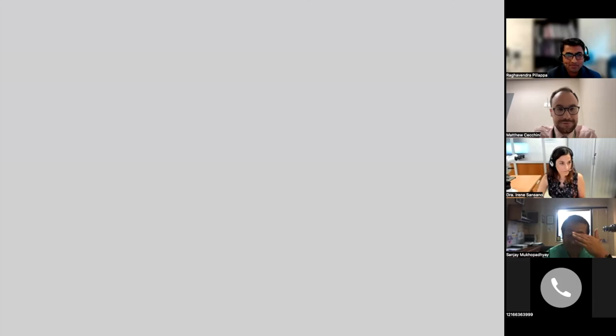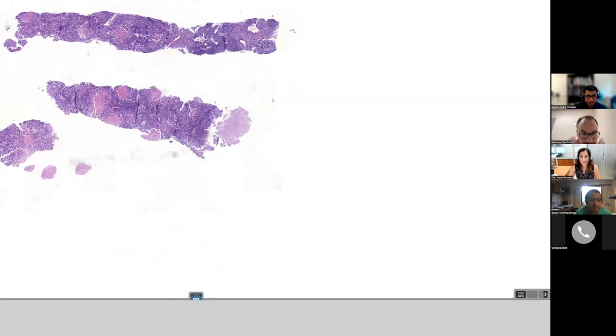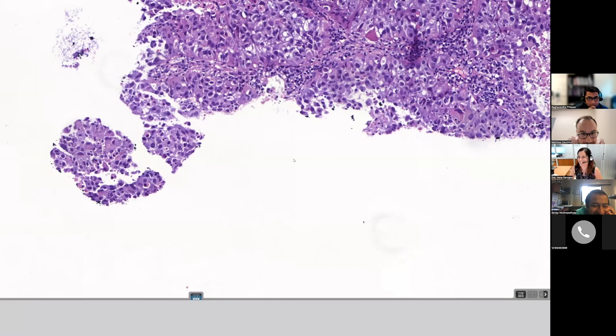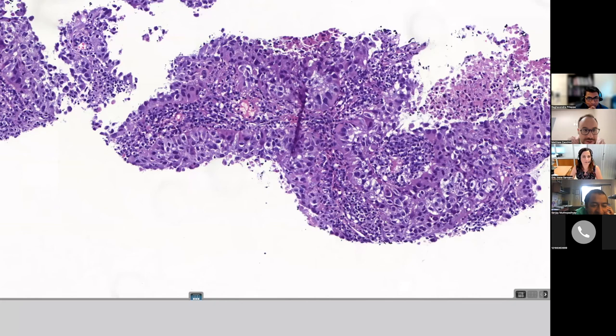This is a 60-year-old man with a mass in the left upper lobe. Again, if some of you want to make a mistake, go ahead. I'm just saying it. No, please be brave. Sanjay was.